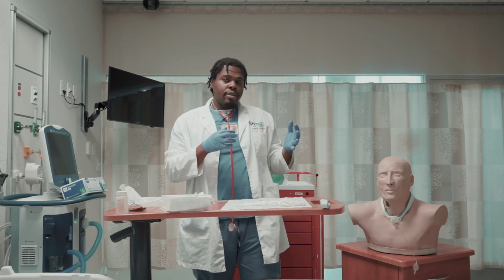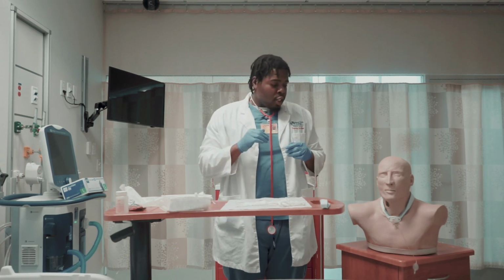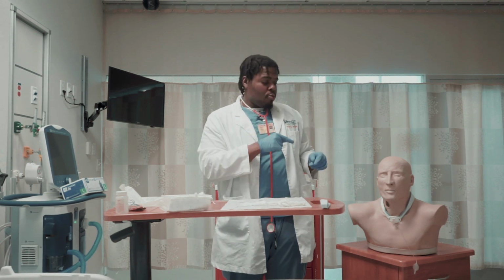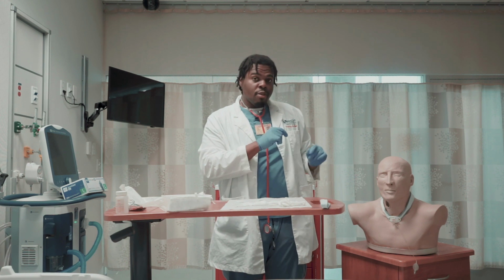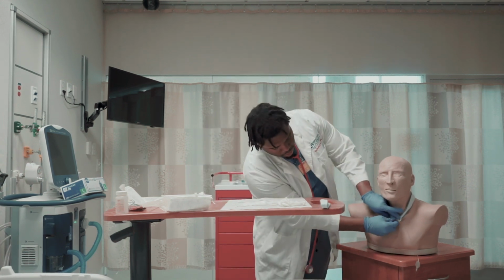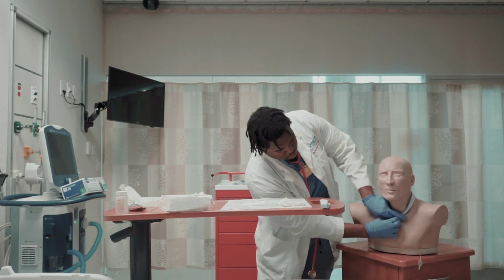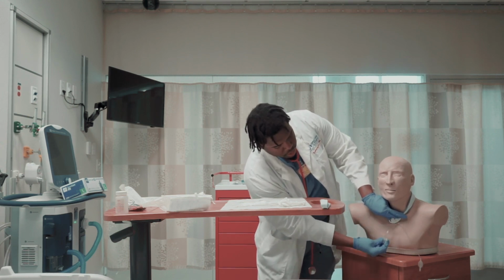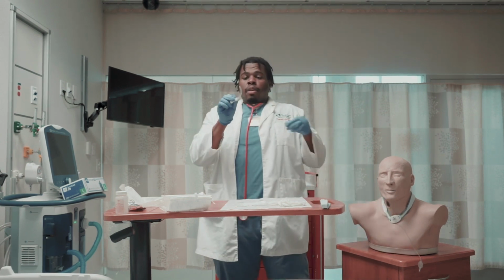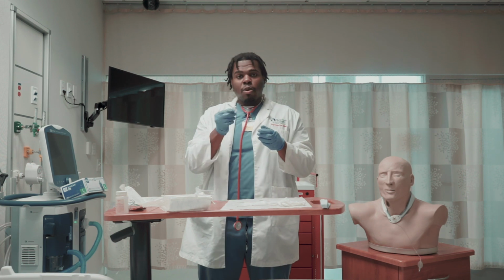After I remove his inner cannula, I'm going to clean it in the hydrogen peroxide. And remember, when removing anything from the trach, hold down the flange. There are two different types of inner cannulas: disposable and non-disposable.